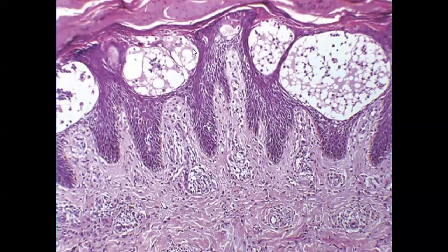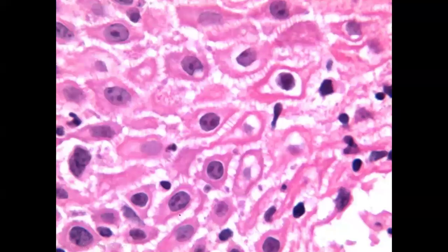Another picture shows a few small, well demarcated vesicles within the stratum spinosum. The spongiosis is highlighted in this magnification, and you can see the desmosomal junctions are visible.